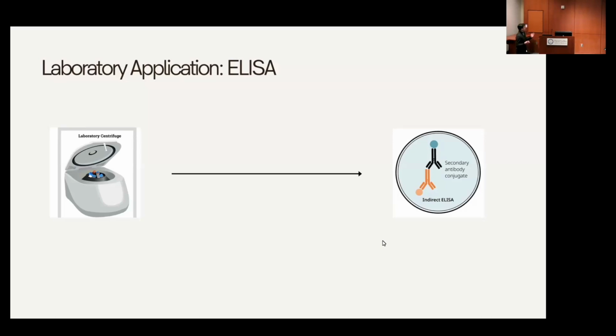spectrometry, and in this case, we see no light, no change in color, so that means there was never any IgE specific to vancomycin introduced in our testing, so that means that their reaction was in fact an anaphylactoid reaction, and it was not a true type 1 hypersensitivity reaction, even though they both manifested themselves exactly the same.